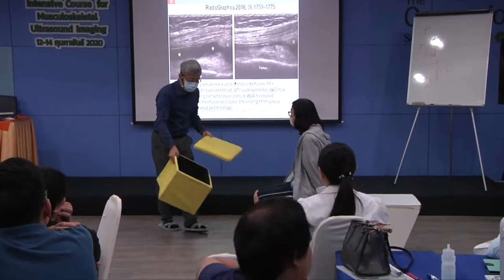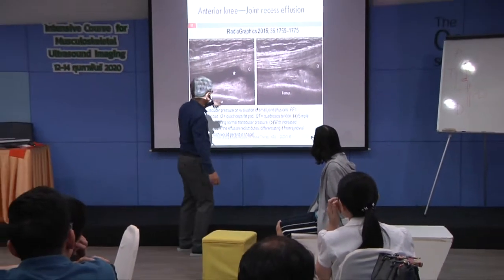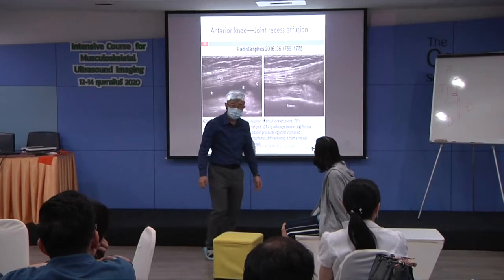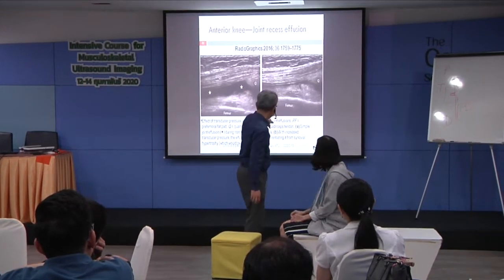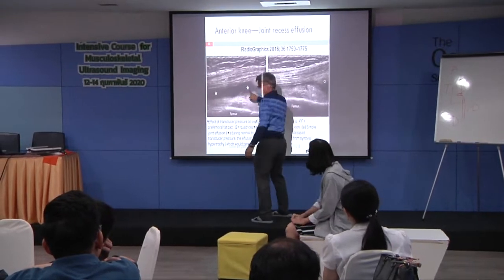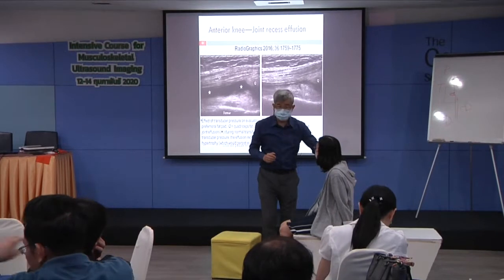So if I find my patient has fluid in the joint, in the suprapatellar recess, I will use a manual technique to confirm this.